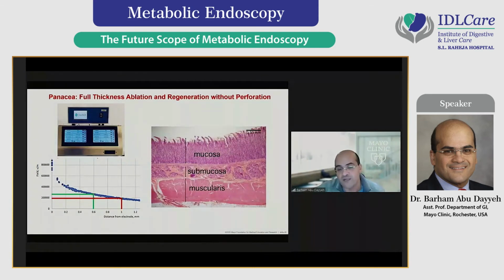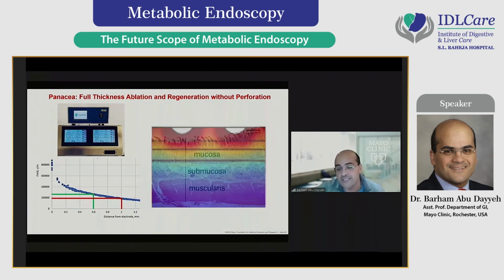The benefit of pulse electrical field is because there's no energy, this field could be tailored to ablate mucosa, submucosa, and muscularis, which could ablate as an adjunct treatment for deeper muscular or submucosal invasion of tumors. But also it could be engineered to create a myotomy without surgery, right? Because it will ablate the muscular structure without interfering with the extracellular matrix.